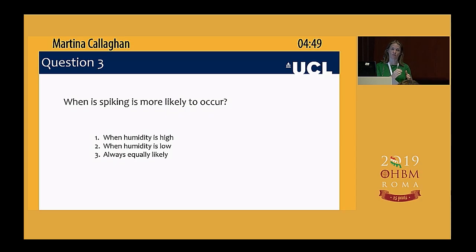But the beauty of Gadgetron is that you could really put anything you wanted in there. So yes, I believe there are reconstructions for multiband. I haven't used them myself. But with Gadgetron, you could also send the data out at different points. So actually, you could probably use the scanner's reconstruction and then send the data out and then do the basic kind of, because a lot of that was just image domain stuff. In fact, all of it was.